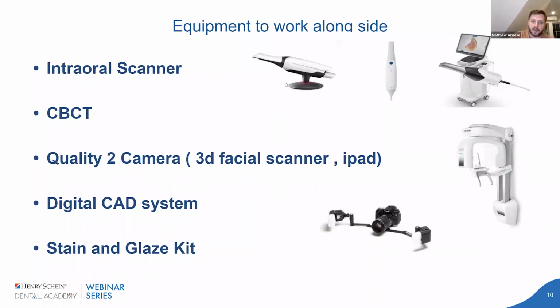Your intraoral scanner. I have 3 Trioses, 2 Medits. I have the Prime Scan. I have the iTero. So I'm fully immersed into intraoral scanning. I maybe take 1 or 2 traditional impressions per year. Sometimes if I want to do a really high-end press ceramic lab case, then I'll do a traditional PVS so that my lab tech can do more of a press ceramic. But mostly I'm doing day in, day out intraoral scanning.